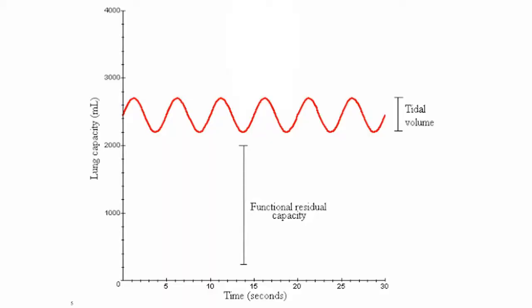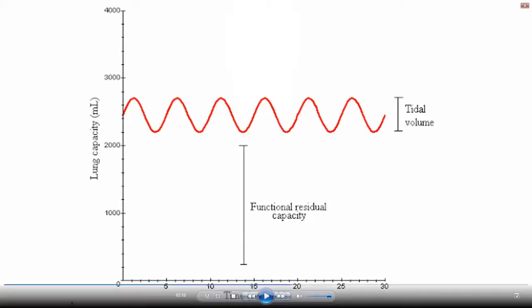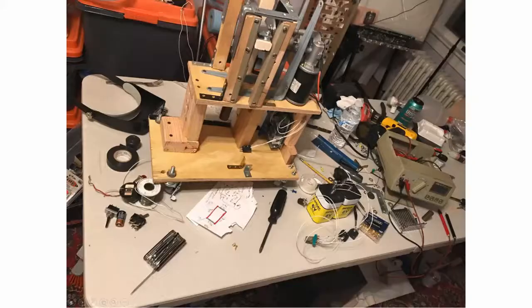Upon running a battery of spirometry tests, I noticed its airflow waveforms needed to be more sinusoidal, like shown here in this figure. This is particularly true for COVID patients under general anesthesia, for example, during endotracheal intubation, where the respiratory pattern is very close to that of a sine wave. This led to a radical redesign of the ventilator. The next prototype shown here in this next slide solved that problem. The following video explains the theory behind it.